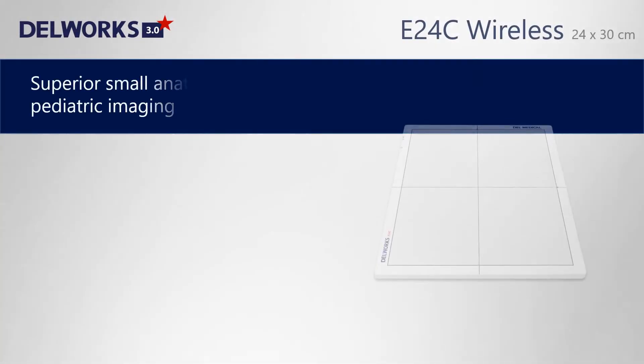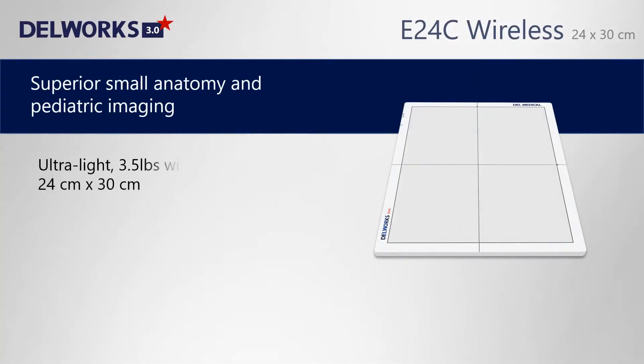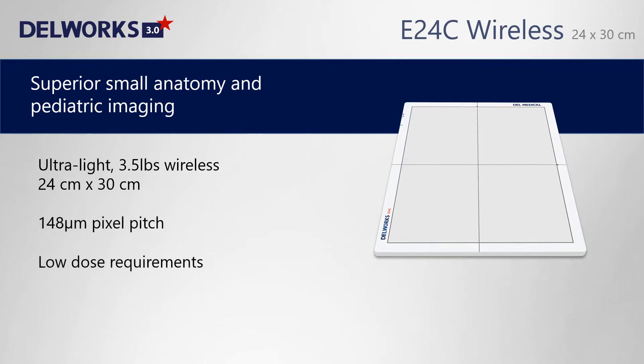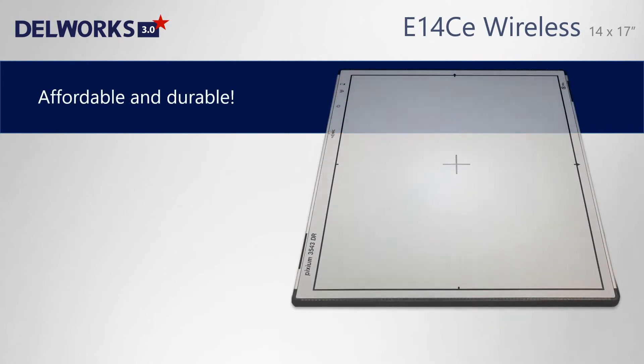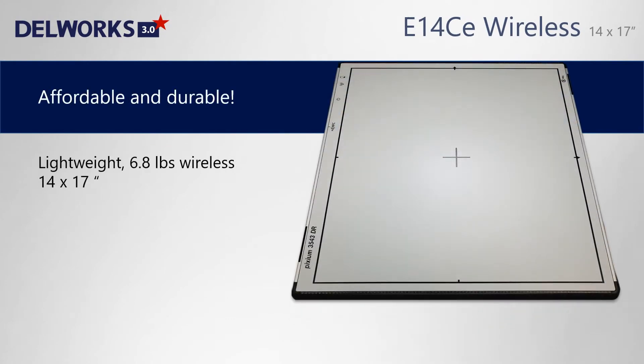The smaller version E24C wireless detector is 24 by 30 centimeters and perfect for small anatomy and pediatric imaging. The affordable E14CE wireless detector is also 14 by 17 inches, lightweight at 6.8 pounds, and includes a mechanical drop sensor.